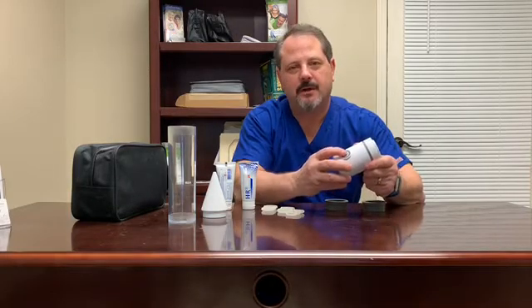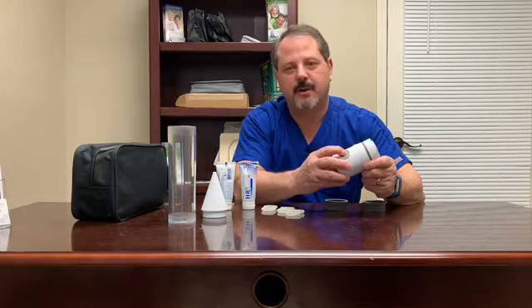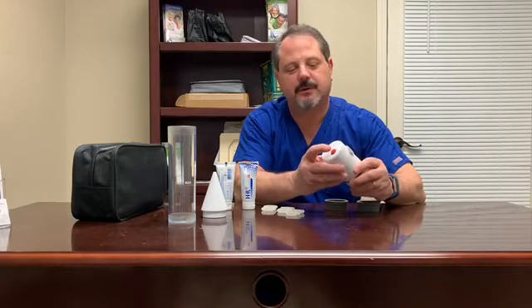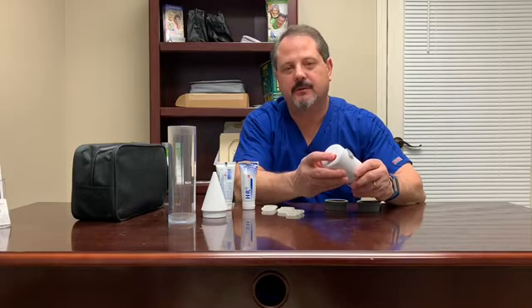This is the on button. You press to make it pump. When you let go, it stops pumping. The red button is your release button, so if you need to relieve the pressure at any time, you can hit the red button.